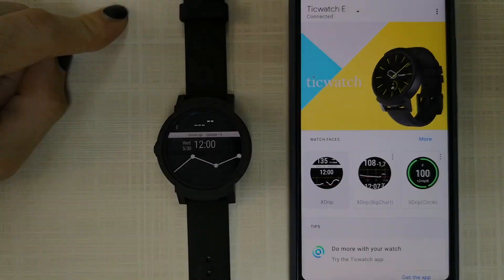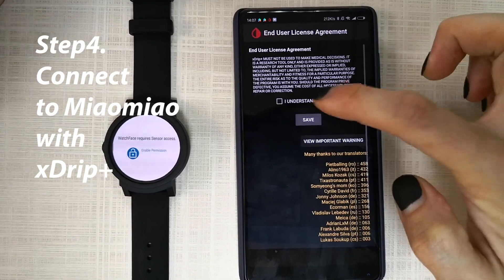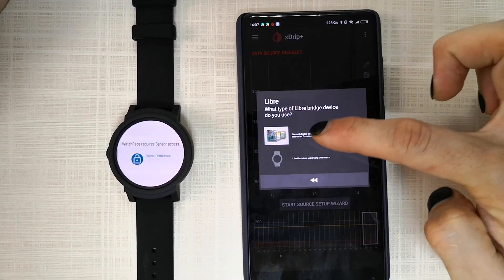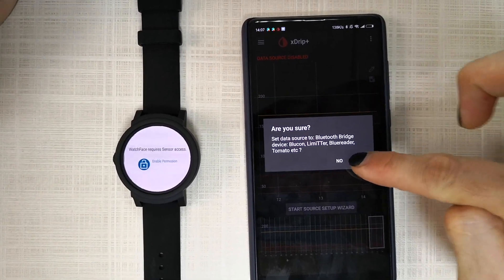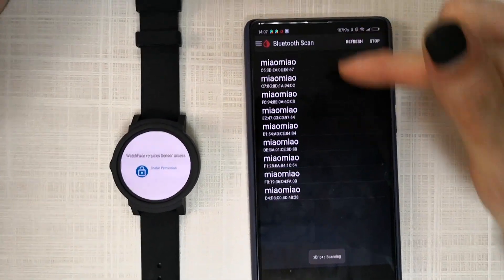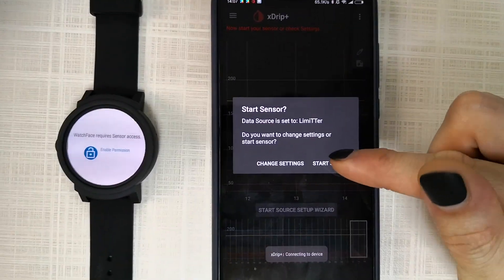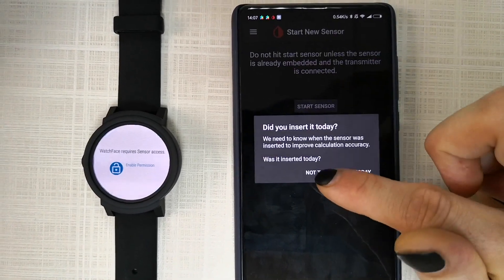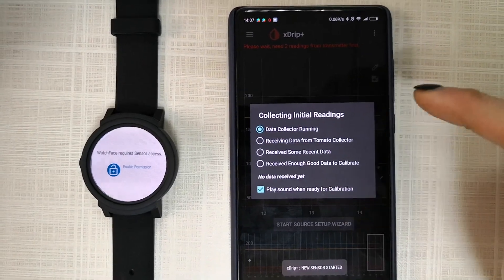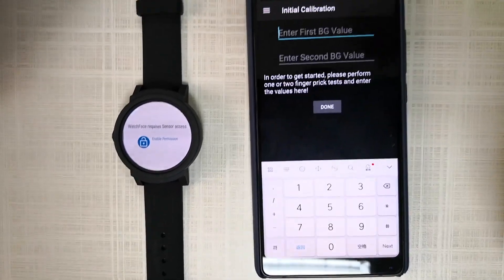Open up your xDrip Plus app and agree to the terms. Here we choose your data source — choose Libre Tomato, then allow. You will find your Tomato sensor here. Press start sensor. If you didn't insert it today, choose 'not today'. It will ask you to calibrate — press yes and calibrate.